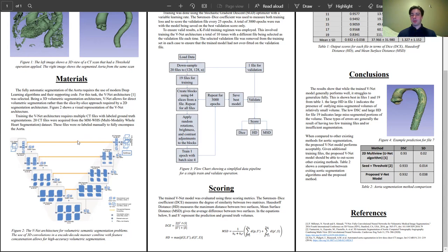The one I'm using is set up to take in data with a dimension of 128 by 128 by 64. That's volumetric data so we treat it in voxels.